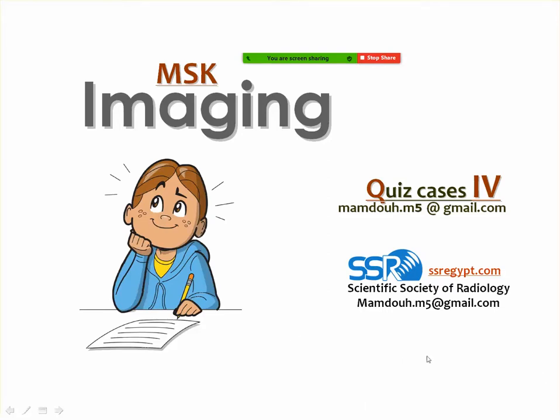The day we'll discuss some of the musculoskeletal cases to review what have been studied during the last month.